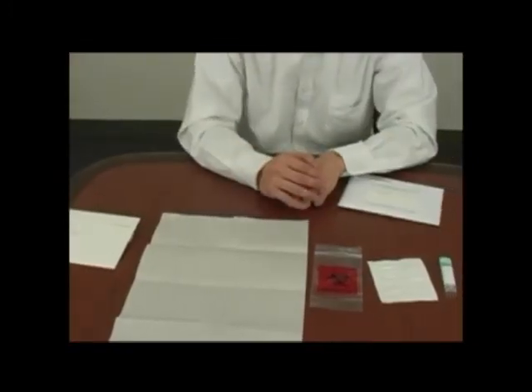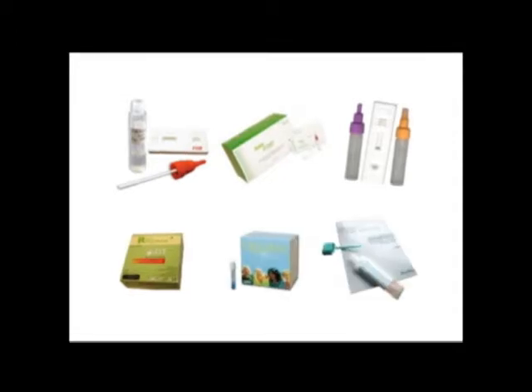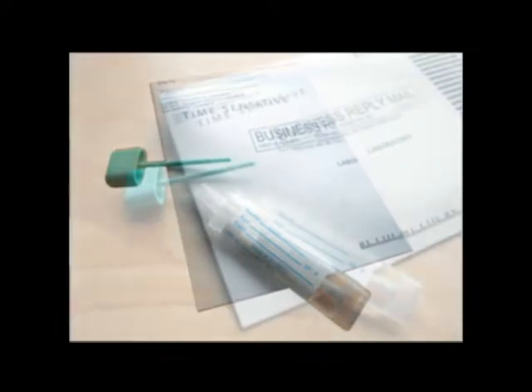This kit requires you to take only one stool sample. Your doctor may have other FIT kits that require two stool samples and may use a card instead of a bottle. But the collection is similar.